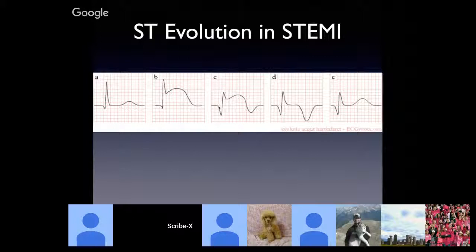It's also propelled backwards relative to this lead that we're looking at, more so than it had been. So the relative difference in voltage potential is reflected by an increase in the Q wave and a decrease in the R wave. So this patient is Q'd out, and they have some dead muscle cell there.